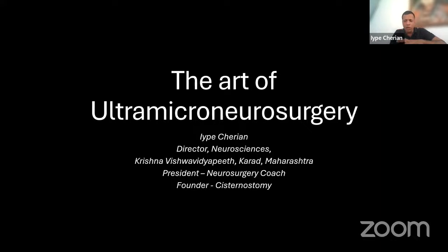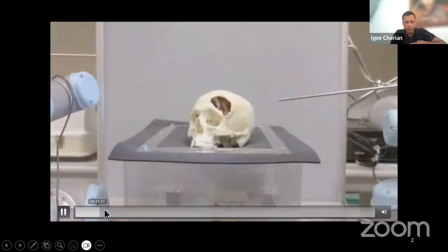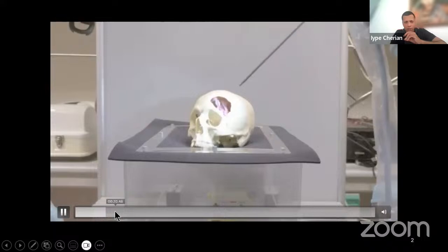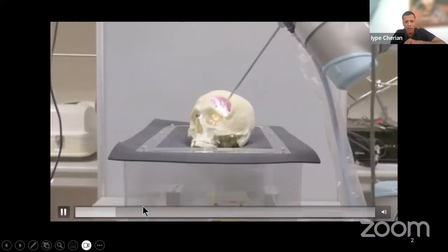You were having loss of stereo depth with 100 zoom, but 80 zoom were having excellent stereo depth. So first, to put you into perspective, exoscope is something that we started working on from 2017 onwards. So this is one of the first exoscopes that we made. This is an exoscope with a universal robot arm, 2 arms with an exoscope and a webcam.